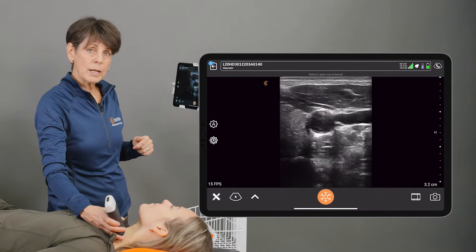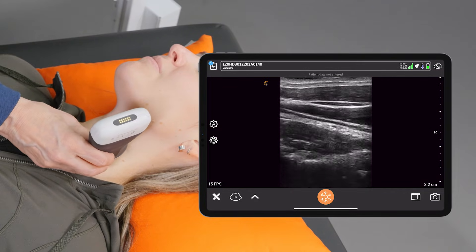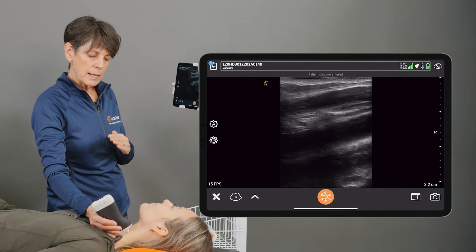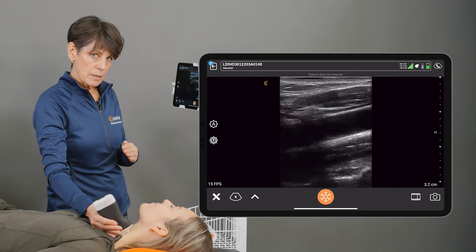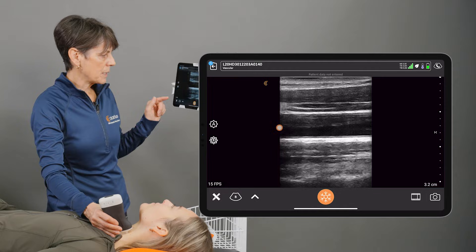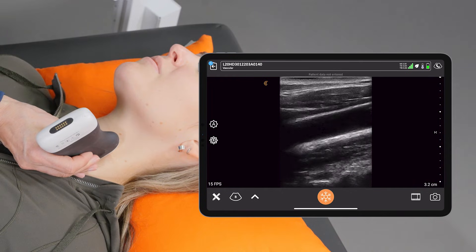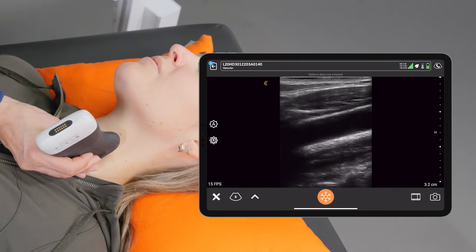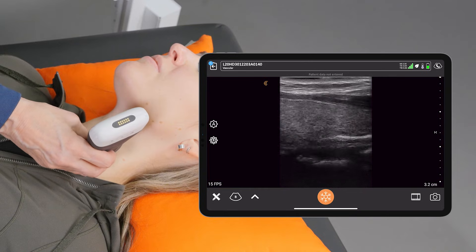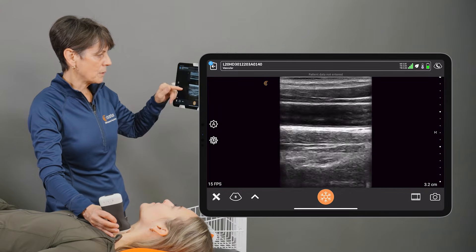The next thing we can talk about is rocking the probe, and that requires exactly that — either leaning on the top of the probe or leaning on the bottom. What rocking does is it makes the sound beam enter the patient at a different angle. Optimally you want to be perpendicular to the structure you're looking at. If I rock the probe one way, suddenly it doesn't look as clear anymore because the sound beam isn't coming perpendicular to that vessel. So you want to rock that probe back and forth until you get the best image possible.